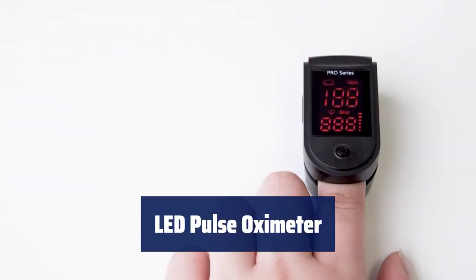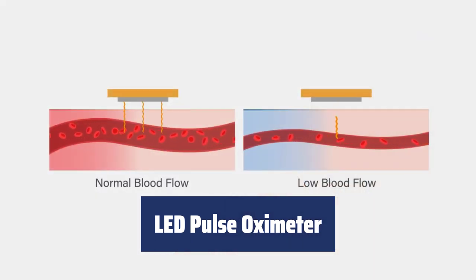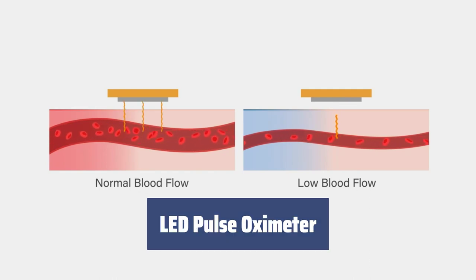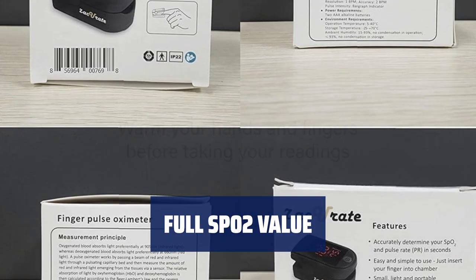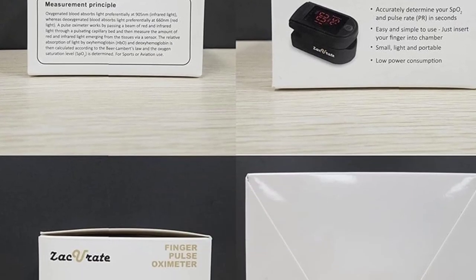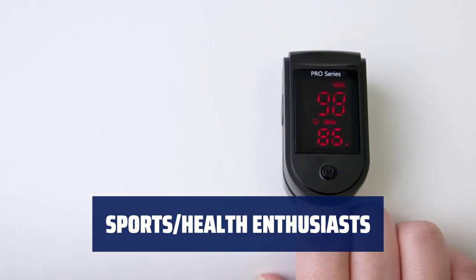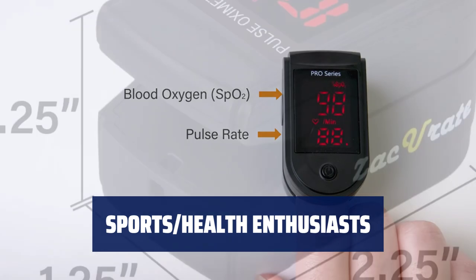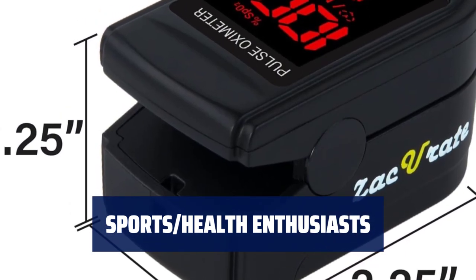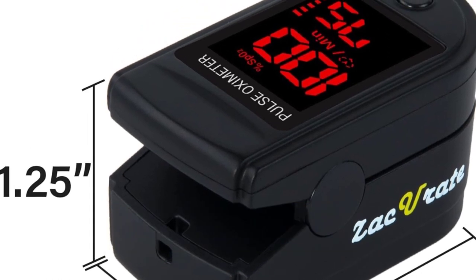Number 5. Accurately determines your blood oxygen saturation levels, pulse rate, and pulse strength in just 10 seconds. The results are displayed on a large digital LED screen for easy viewing. The only pulse oximeter that can read and display SpO2 levels up to 100%. The LED display is user-friendly for quick readings.